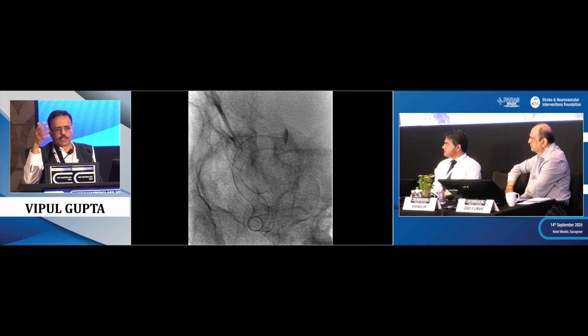So fish mouthing, as I laid out: you deploy the stent at the curves, it can fish mouth. You use too much force, it can fish mouth. You use a microcatheter to manipulate, you can distort the stent and fish mouth. And Dr. Vincent said that on follow-up, intimal healing at times in younger people and in women can lead to distortion of the stent. In the acute phase, if you have any doubt, one can deploy a laser cut stent with a good radial force to oppose it well.